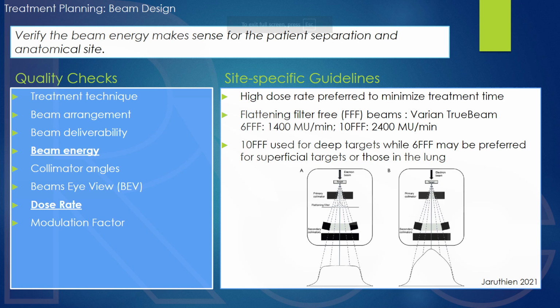And the overall dose distribution tends to be more compact, more tight by using that non-coplanar arrangement. But like Dr. Lin said, I don't know of clinical trial data that suggests that what we think may provide an advantage actually makes a meaningful difference in terms of clinical outcomes. I just don't know that.